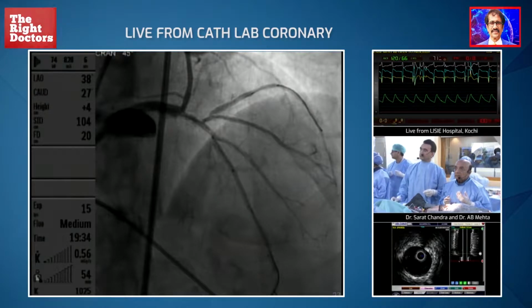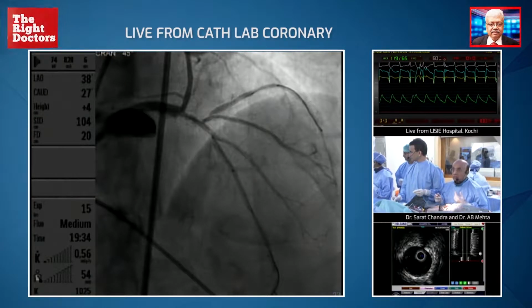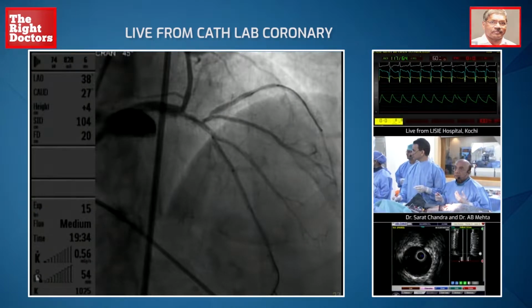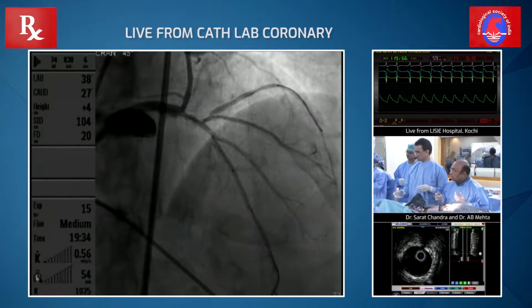Wilson, ready with the balloon. Okay, so show us And this. then So if you go now to the IFR, please. If you could just show the IFR screen. Go down one. So this disconnected. No, no, I just want to show them the IFR. Okay. So can we go to live so Do you do IFR?